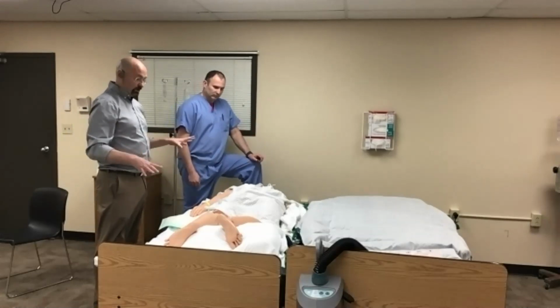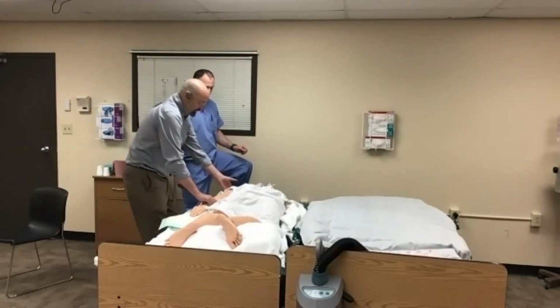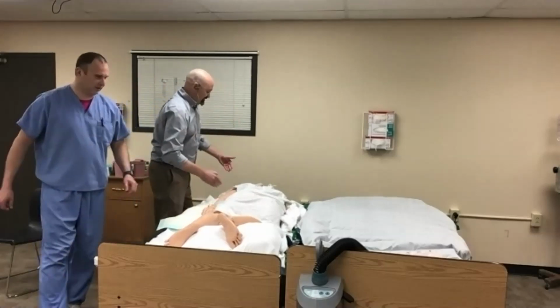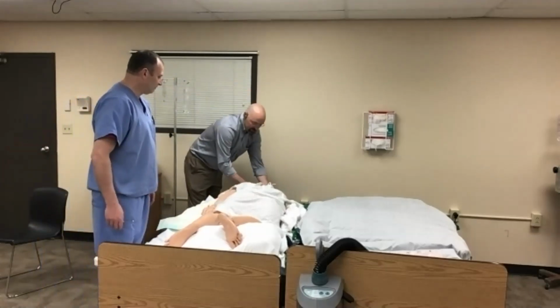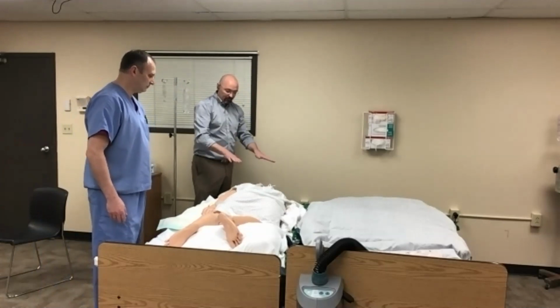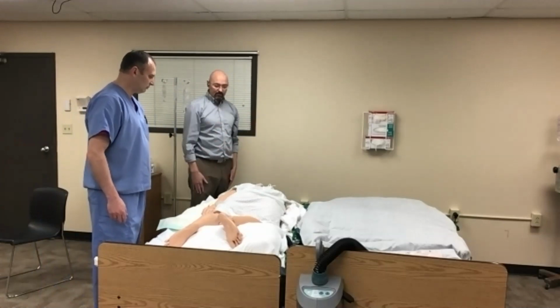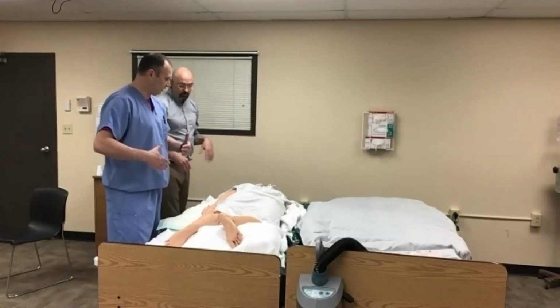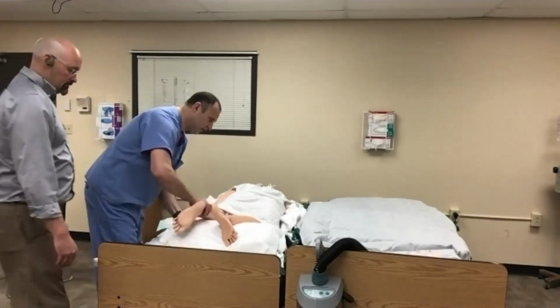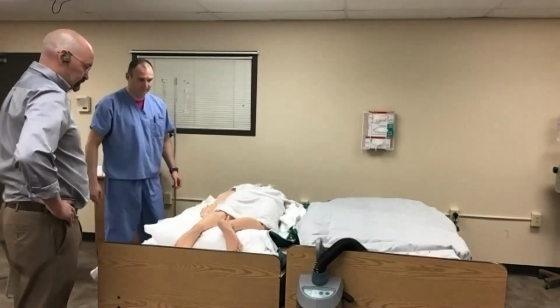You're going to have the manpower to manage all the things that need to be managed. So from here, we can now boost or turn him slightly using the HoverMatt. You then can apply this. His arm's not going to go; his arm doesn't articulate that way, but, and do the swim position. You can control the airway both. If you need to move him up or you need to inflate this to get access to things, you can still do that by inflating the HoverMatt and tucking the pillows underneath. The pillows are right at the chest, the pelvis, and then below the knee to make sure that we get the heels and toes up off the bed.